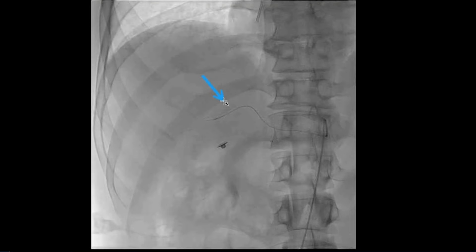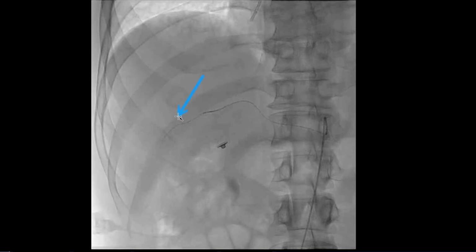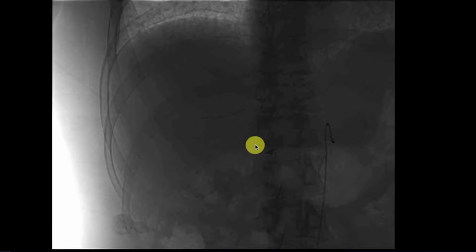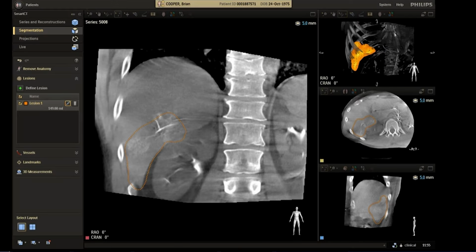With X-ray guidance, we can navigate this tiny catheter into the branch that we want. And this is the branch to the segment 6. Again, we can do a 3D image. And then we can calculate exactly the volume of that segment that we're treating. Here is a 3D picture of the segment of the treatment area. And we can get in real time exactly the calculated volume that we want to treat.